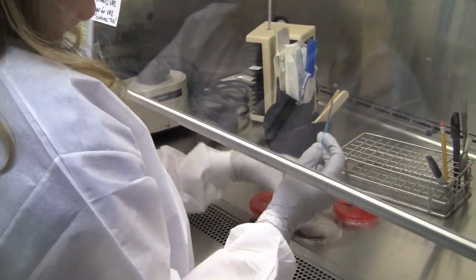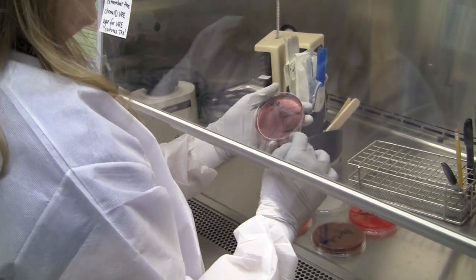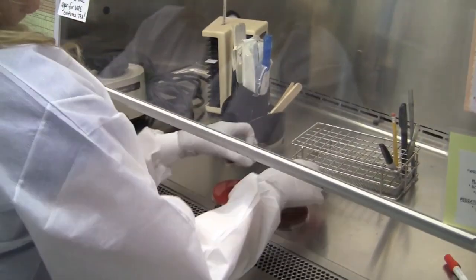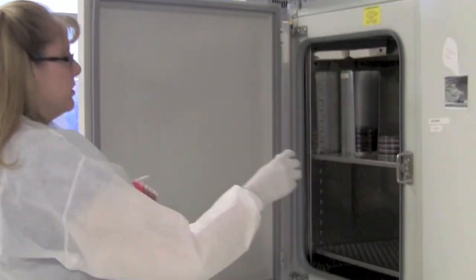A loop further streaks out the specimen on the agar plates. The plates are inserted into an incubator to allow any germs to grow.